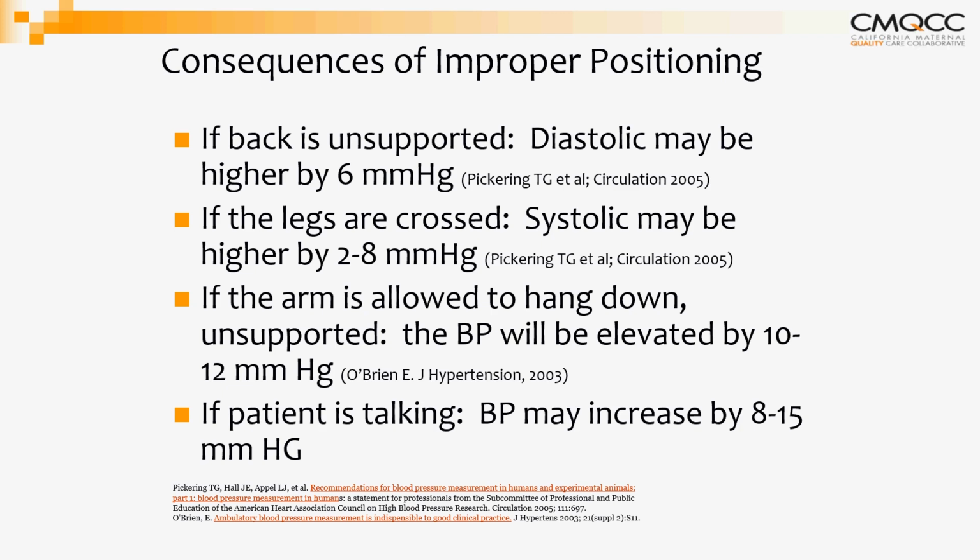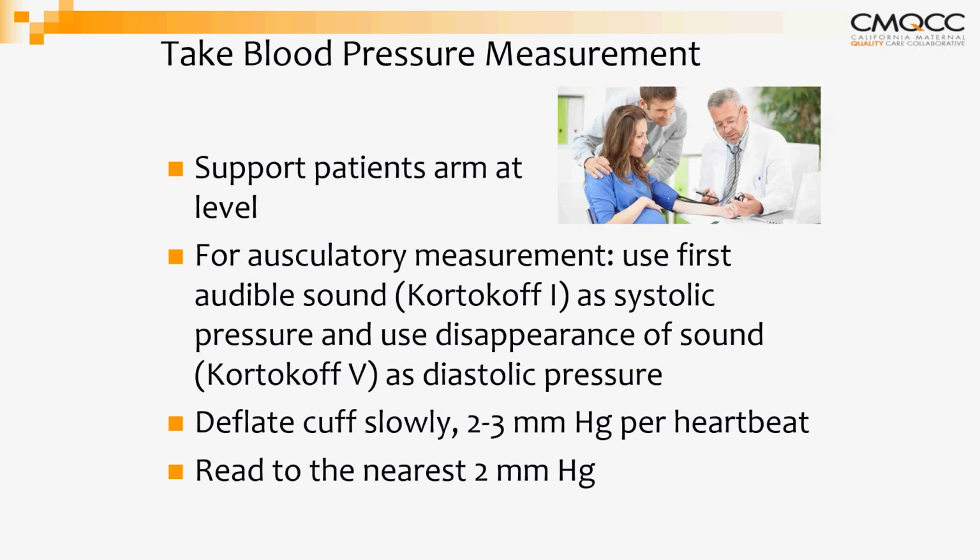If the patient is talking, again, depending on what's going on with her, you can see how much that can change and increase the blood pressure. So it's really, really important that this is discussed with staff and that these practices are followed because, again, it can lead to inaccuracy. And just remember that we know that pain and anxiety can also increase blood pressure, but again, it's not an excuse to not retake or to not follow through if the patient is in pain. Once she's been given some analgesics, if possible, recheck the blood pressure and see whether there is any difference in what was taken. Next slide, please.